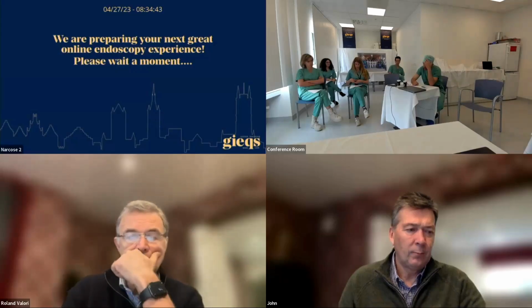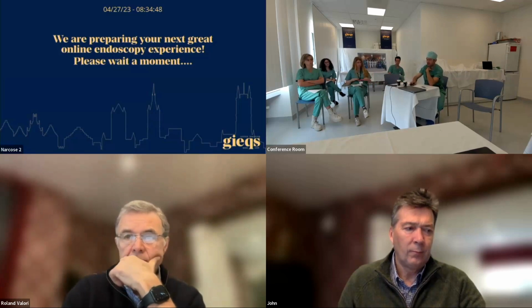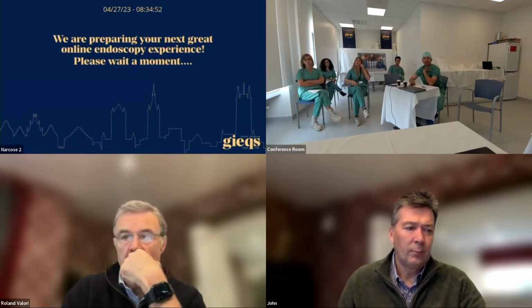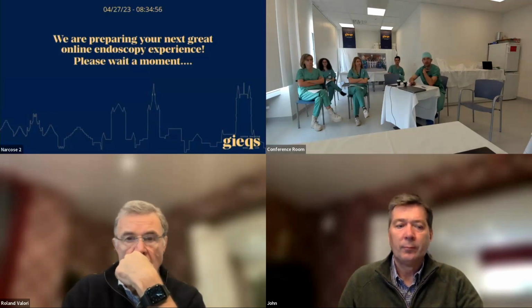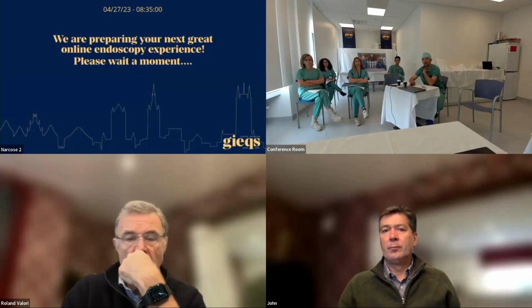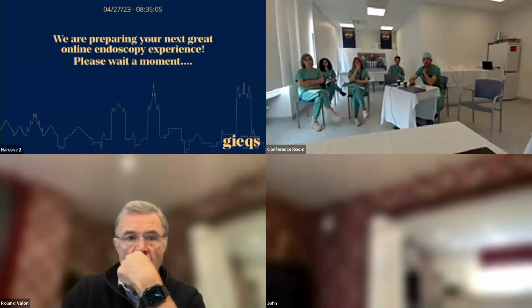In the meantime, while they're getting set up, why don't we start with about 5-10 minutes of lesion assessment, because they've got to get the scope into the cecum. So we'll just stop this and we'll go. So Sybil, you already said that you want lesion assessment, right? I think that's something a bit theoretical, and obviously something you have to do in real life. So let's do the theoretical bit.